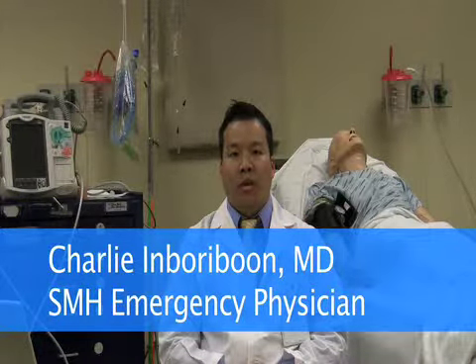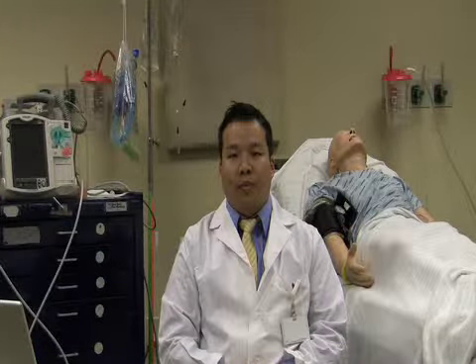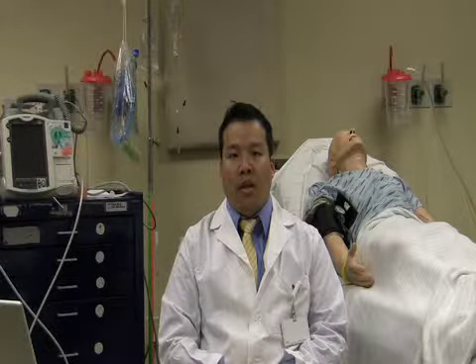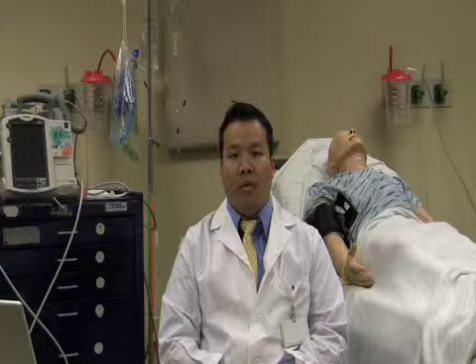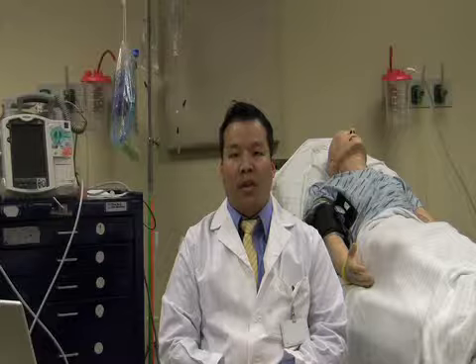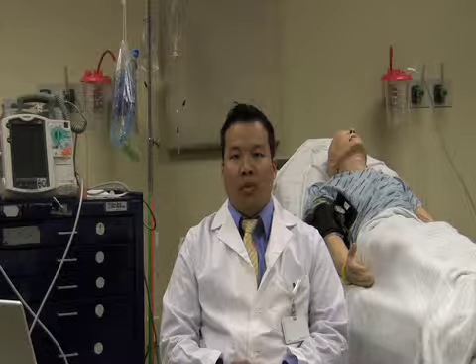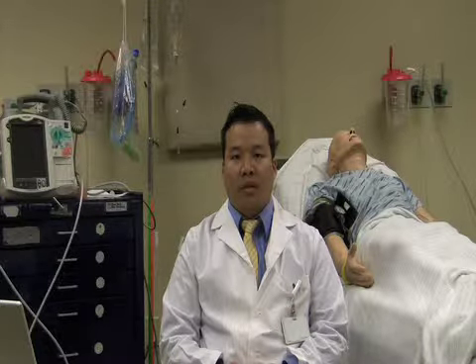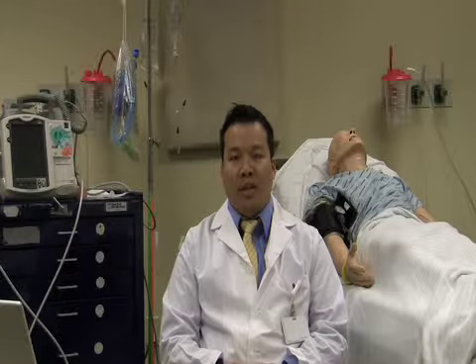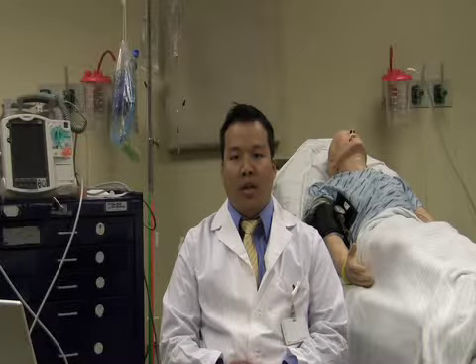This may be either symptomatic sinus bradycardia, sick sinus syndrome, or high degree atrioventricular block. In addition, in a rare selected population of patients, it may also be used for overdrive pacing to prevent tachydysrhythmias. Pacemakers are typically triggered when there is absence of electrical activity over a set specified period of time. This is normally programmed by the cardiologist that is managing the pacemaker.